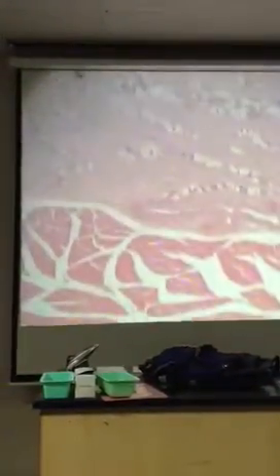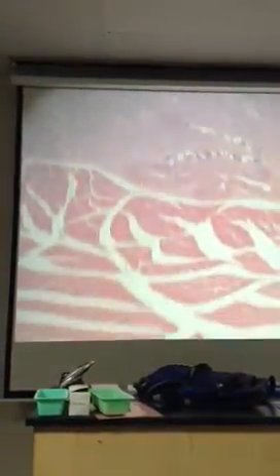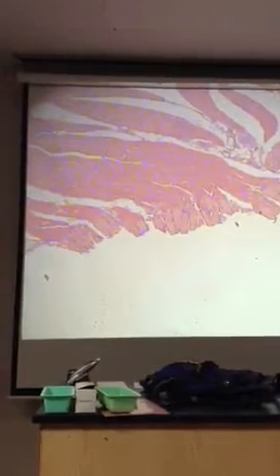And all of that is the muscularis externa, because the stomach has a really thick muscularis externa, with 3 layers of smooth muscle instead of the 2. Okay, so this is very thick. And it just kind of ends here. It just doesn't look like it's a complete section, so we don't see the serosa there.